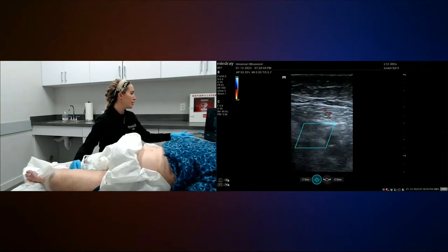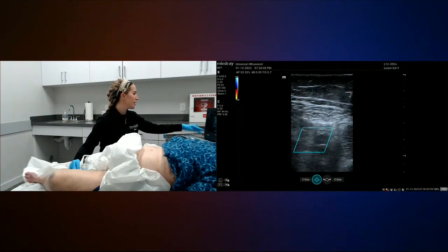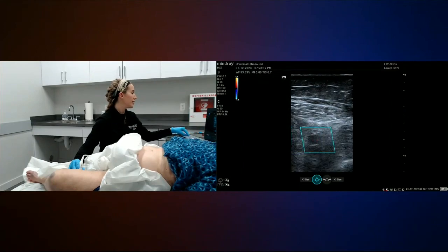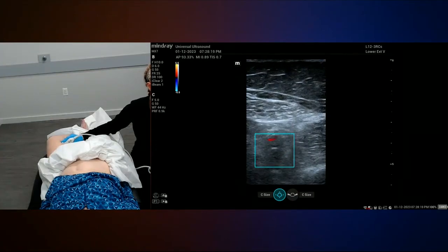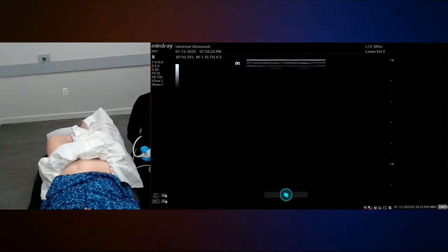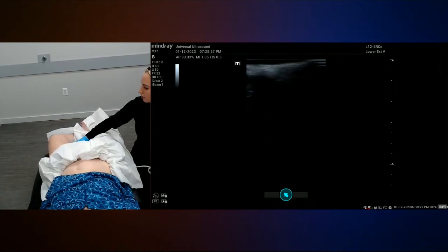If you're unsure, you know, always put your color flow on. And let me just steer that. So we can delineate artery and vein. So you can see that's the artery on top and vein on bottom. Go ahead, augment your foot for me, please. There we go. We have no flow in that vein. So I'm going to go ahead and go to the popliteal area above knee, mid, and see what that looks like. A little cold.